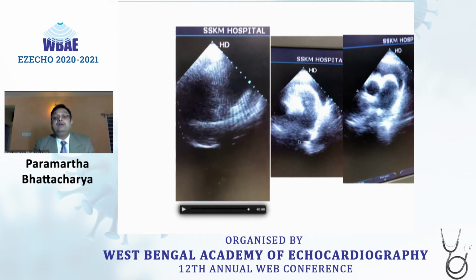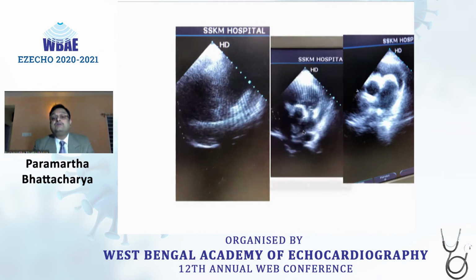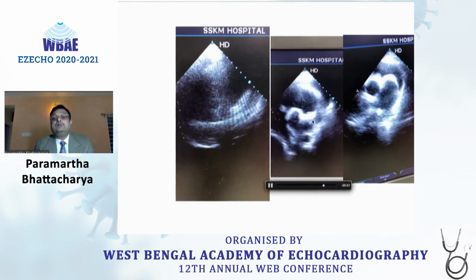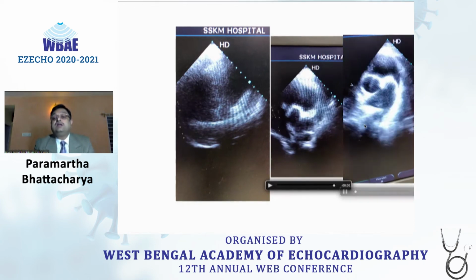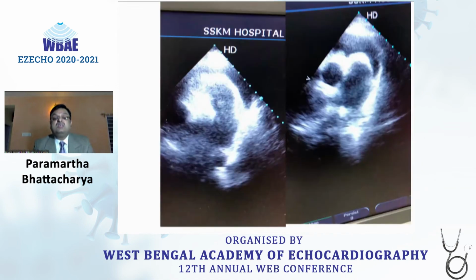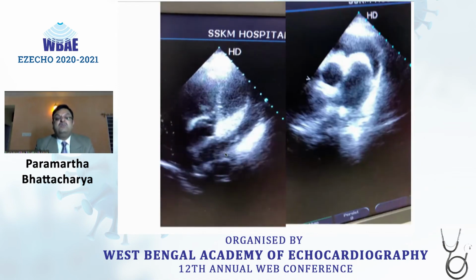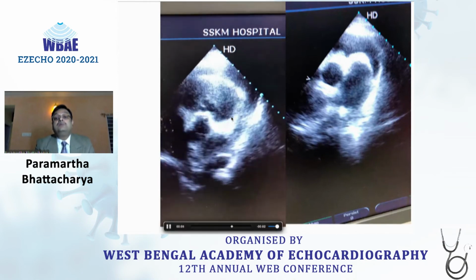We thought we were dealing with a case of multiple thromboembolic episodes in these patients. They wanted to open up the pulmonary artery. The pulmonary artery looked this way, and there was another part of the vegetation. So initially we thought that it was another vegetation, but we found out it was the same vegetation that was popping almost out of the tip of the pulmonary artery.